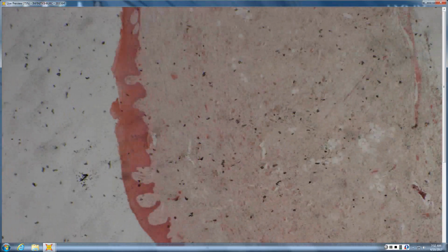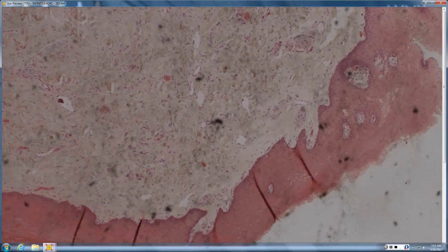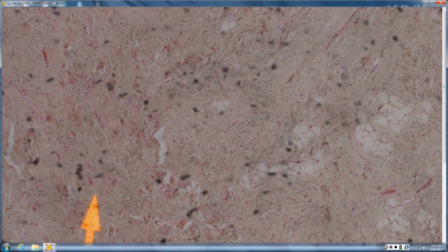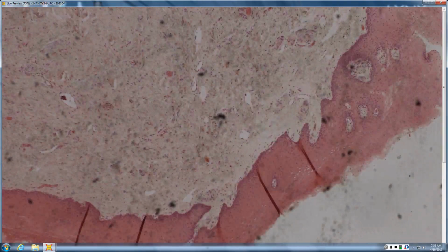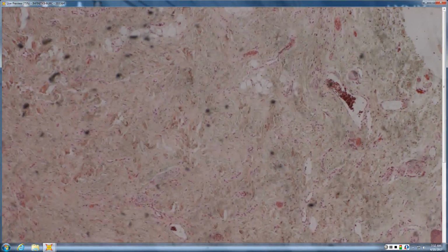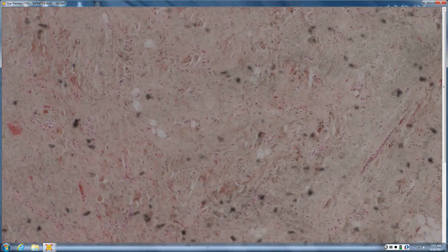You have a papule of some sort, and does it look like skin or more like mucosa? It looks like mucosa. And does that look like a submucosa, or is it bundled like a dermis? Bundled like a dermis. So we've got a disconnect there, right? Because the lining certainly looks like mucosa, so somebody's lying. Either the dermis is a fibroma or the mucosa is lying. Which do you think it is? Maybe the first one. Yeah, so this is a benign submucosal fibroma, because a normal submucosa doesn't have any bundled collagen at all.